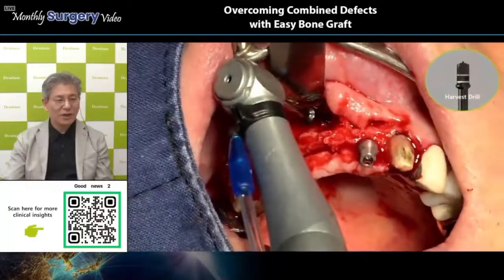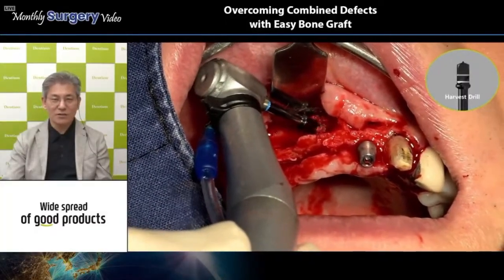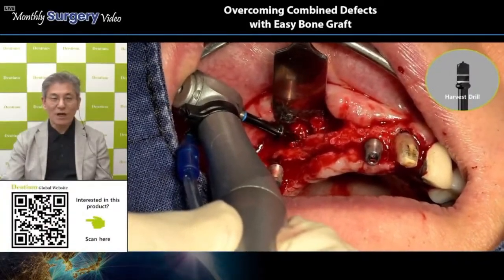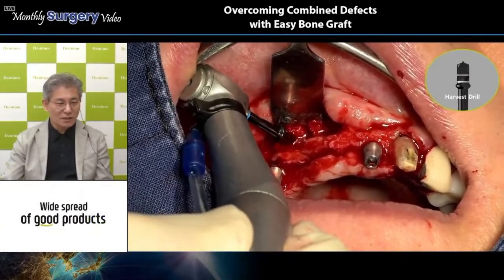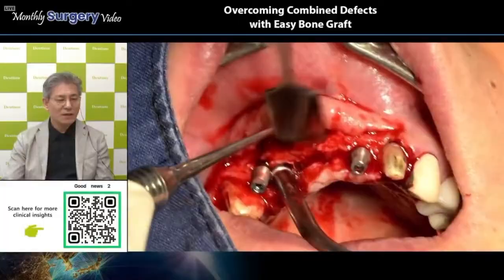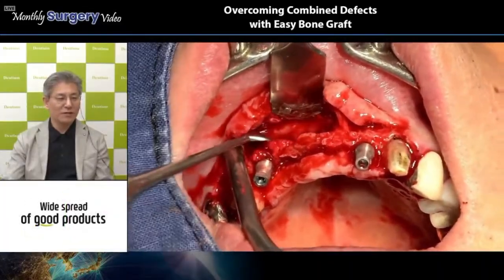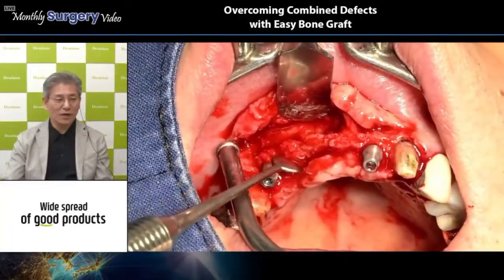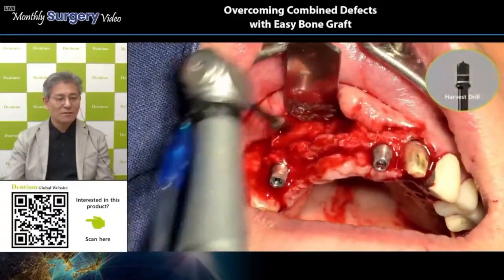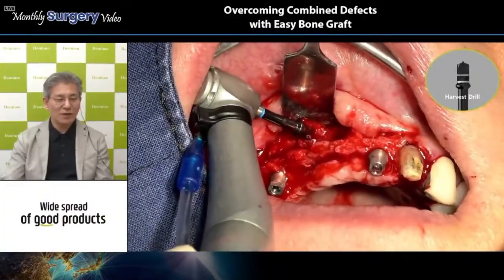Okay, now 200 RPM with the harvest drill. This harvest drill is designed for harvesting autogenous bone around the surgery area. So 200 RPM without saline irrigation, in the clockwise direction, and we can harvest this autogenous bone from the labial area. It's a very simple and efficient way to take autogenous bone, right? So this autogenous bone was achieved once more using this harvest drill, 200 RPM without saline.